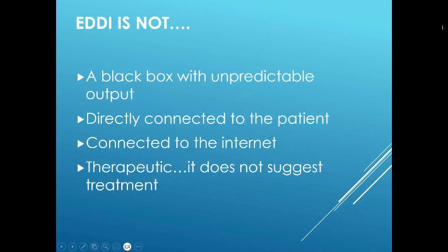As previously stated, EDDI is not a black box with unpredictable outputs. Neither is it connected directly to the patient. It is connected to the normal anaesthetic monitor by a cable. Depending on the circumstances, it could be a USB or an Ethernet connection. It is not connected to the internet, and it does not need to be. It is a completely standalone system. Depending on local systems, it could be connected to a local server.